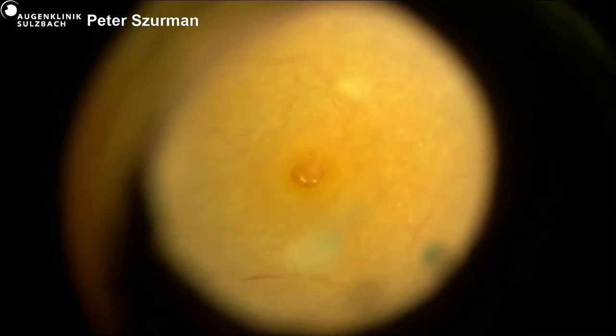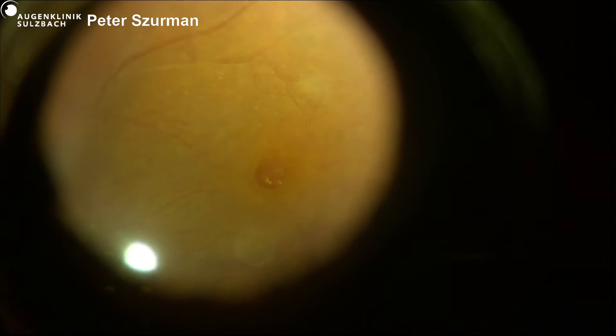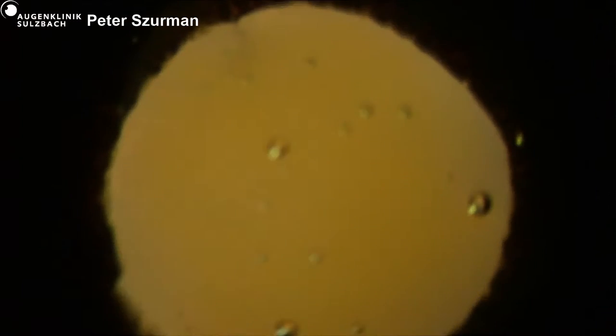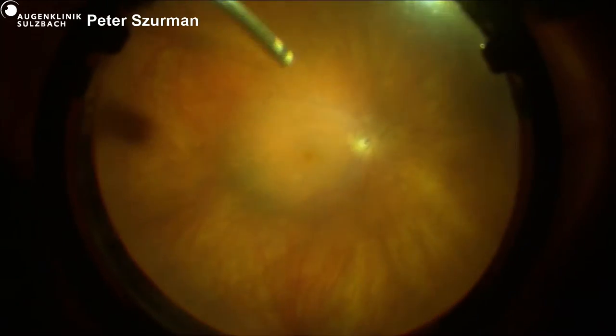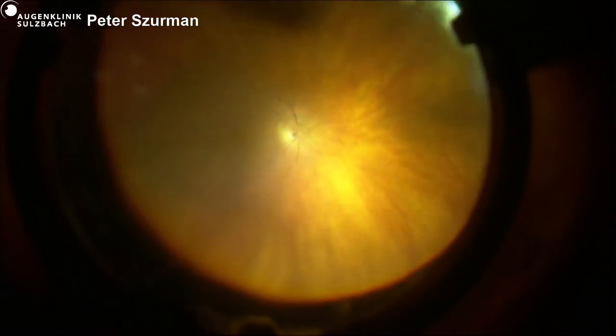Thank you, Claudio. We will go now to Dr. Barak in OR4. Adiel, we're back with you in the operating room. We see an air fluid exchange being performed. Why are you doing the air fluid exchange? Why an air fluid exchange in this case?